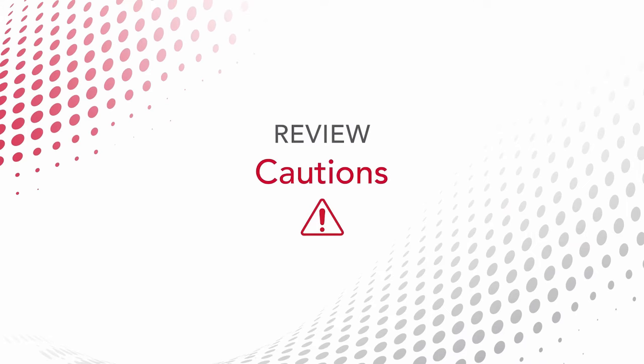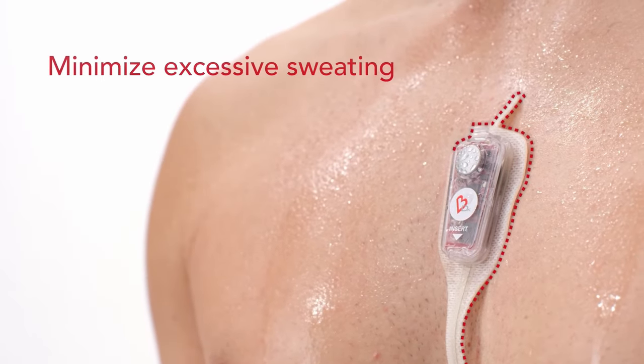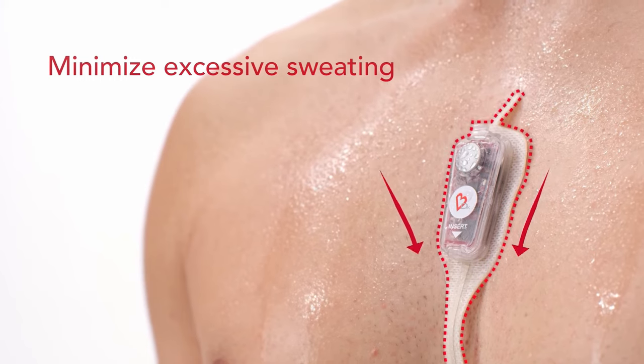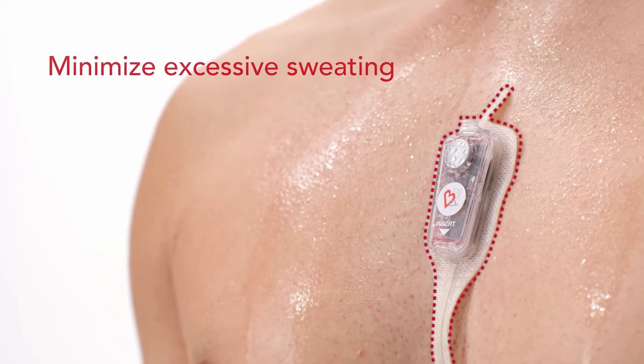To ensure optimal ECG recording, reinforce the following cautions with the patient. Avoid showering, bathing, or exercising following application. For the remainder of the wear time, avoid activities or environments that result in excessive perspiration, as this may result in a decreased period of patch adhesion and monitoring.